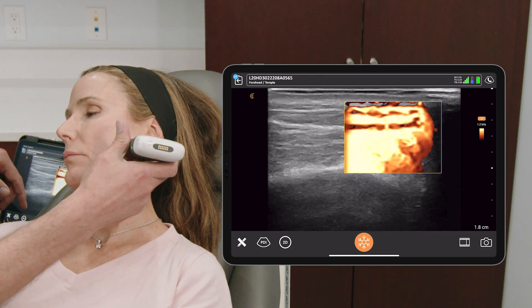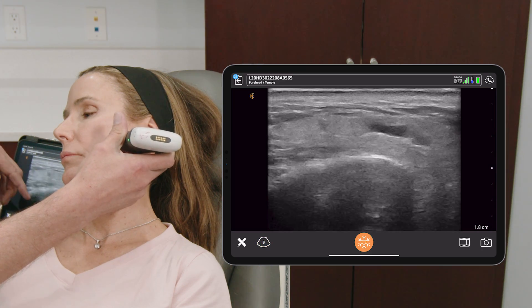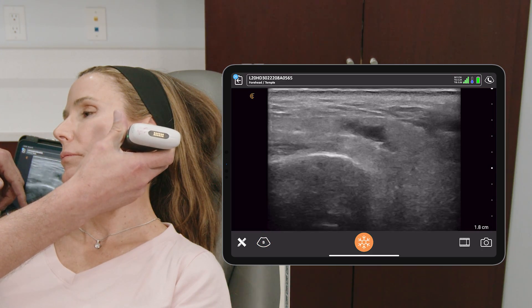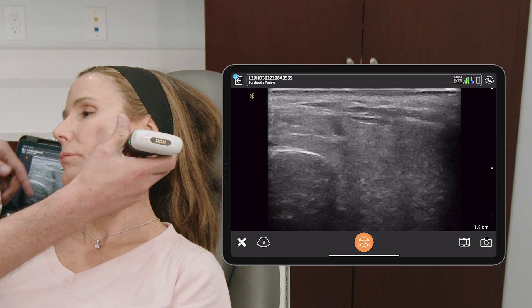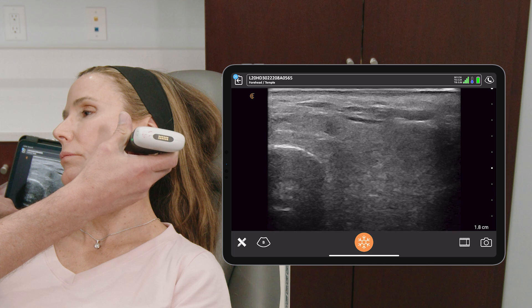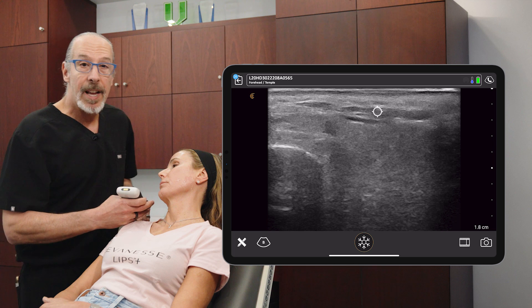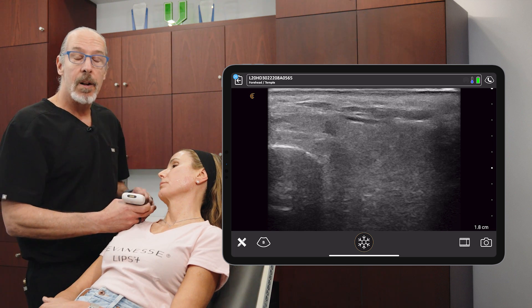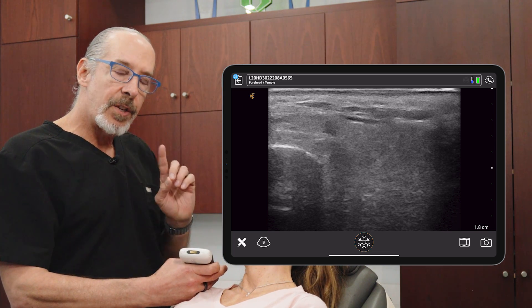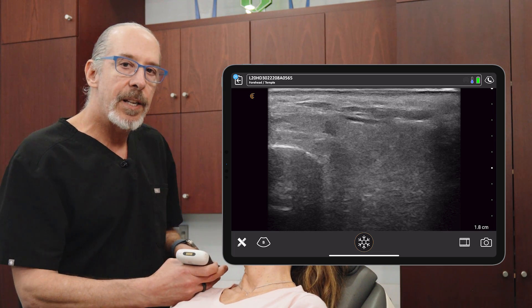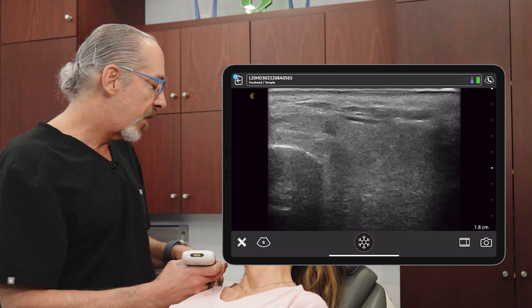Let me put it back to B mode. You'll notice that when you're in this area there really isn't a lot of area to inject, and that's why the parotid does get injected frequently. You need to inject in this area right here, which is between the skin and the parotid gland — and sometimes that's as small as one millimeter. It's particularly scarred in patients who have had a facelift. So just be careful when injecting this area about going too deeply. You want to be just below the skin surface, just below the dermis.